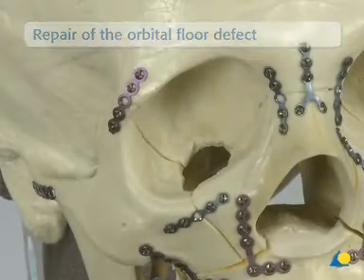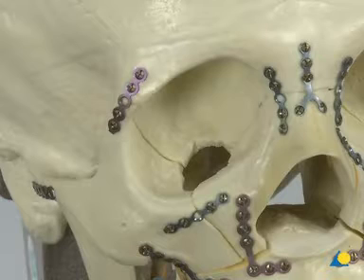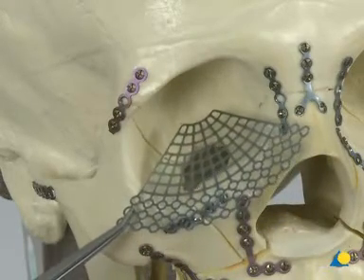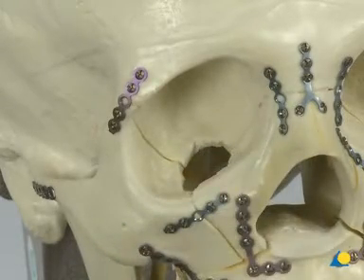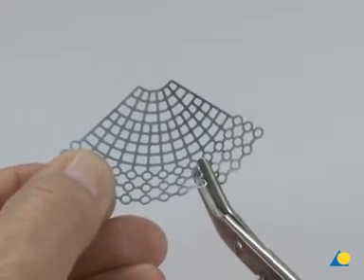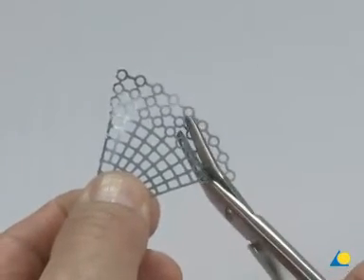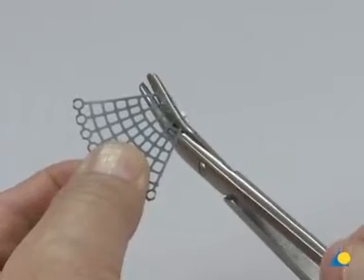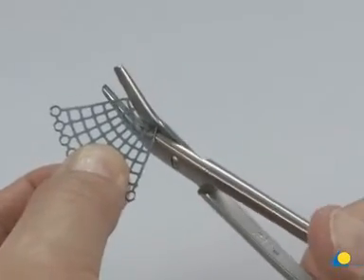In a clinical situation, after the orbital floor is exposed, an orbital retractor cap can be used to elevate the orbital contents. A 0.3 mm thick orbital floor mesh plate is selected to repair the orbital floor defect. The radial design fits the conical shape of the orbit. The mesh cutting scissors are used to trim the plate to the correct anatomical size. It is important to use a large enough plate to span the entire defect, with enough screw holes to fix the plate posterior to the inferior orbital rim. One or two screws are adequate.